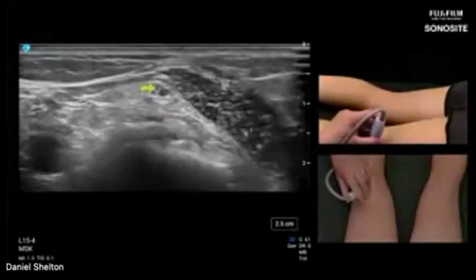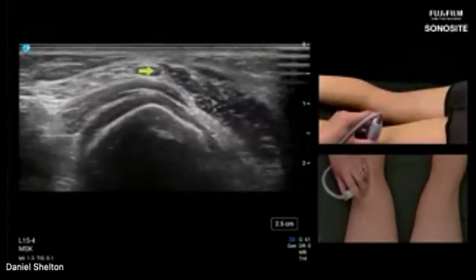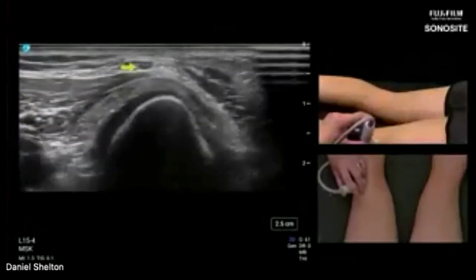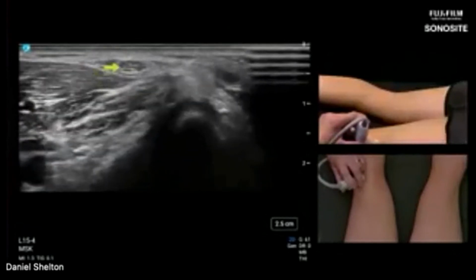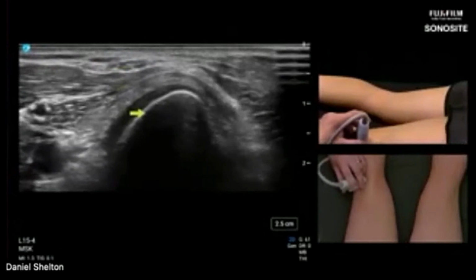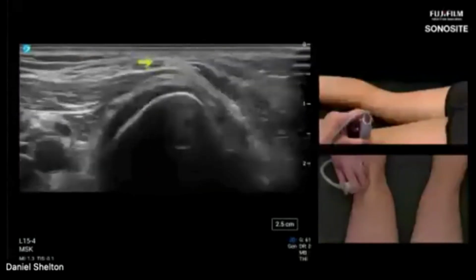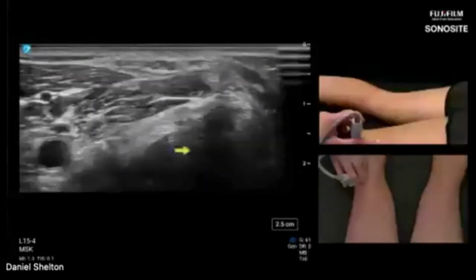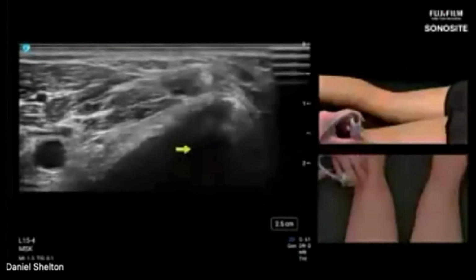And let's follow this peroneal nerve as it borders biceps femoris. Keep following it, keep following it. If it's just the nerve that we're following. Okay, so we went from posterior femoral condyle, right? We're about to jump over the joint. So here's the joint line, just to put things into context where we are on the screen.